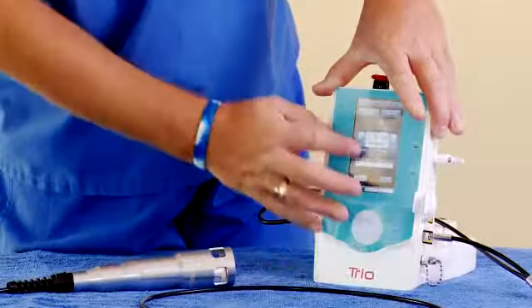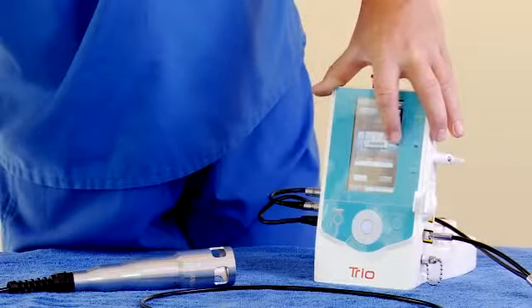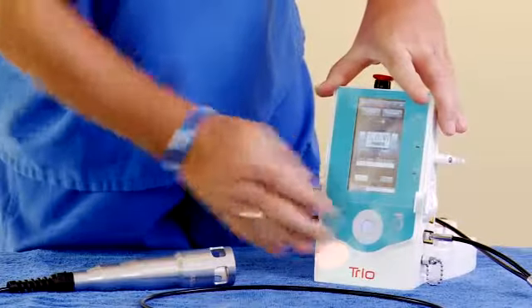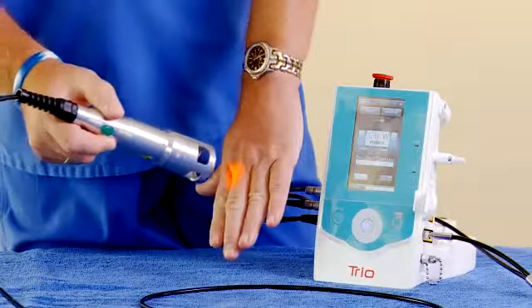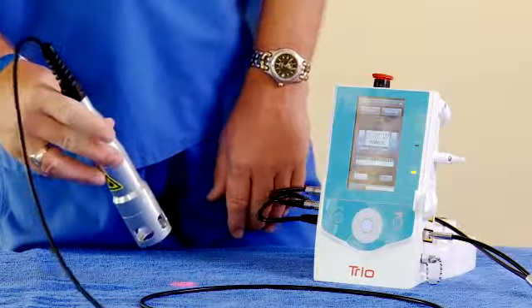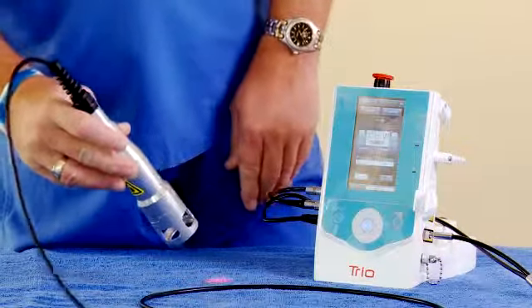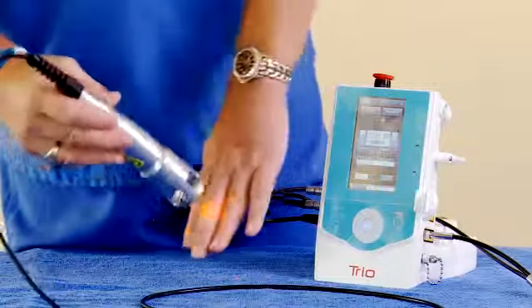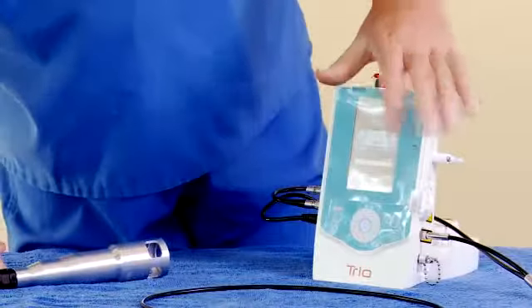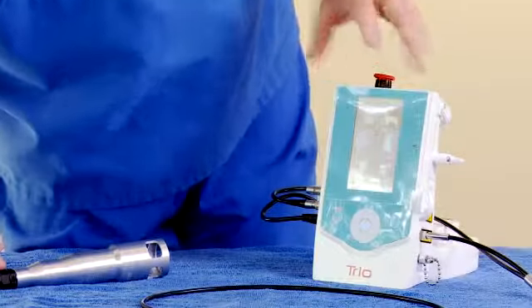At that point, you can either use the 4-way key or the touchpad to adjust by 0.10 of a watt. So if we want to turn up to 3, and then we go right to ready, now the laser targeting light is on. Once you're ready to treat, you can depress the finger switch, and you'll hear a beeping sound that shows that the laser is operating. You can depress it again to go to standby and just have your targeting beam. And then you can go to standby on the laser to adjust the treatment wattage or to go back to your main protocols.